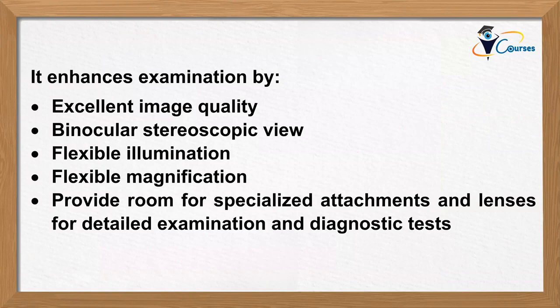So how can it enhance examination? It enhances examination by excellent image quality with a binocular stereoscopic view, since we have the virtue of binocular vision, flexible illumination and magnification, and it also provides room for special attachments, like the use of applanation tonometry, the use of special lenses, and other diagnostic tests.